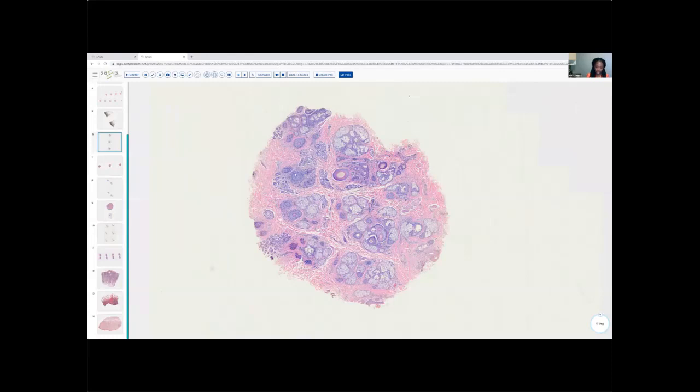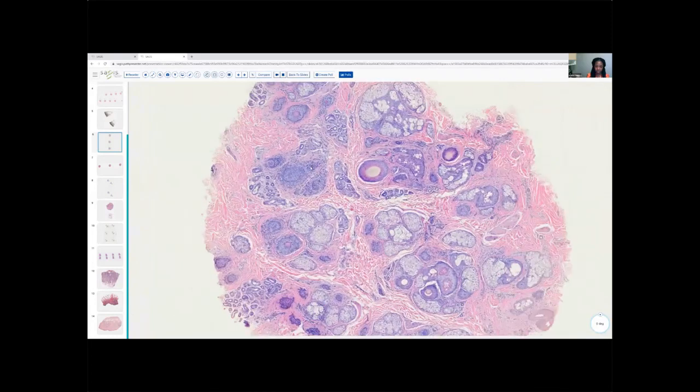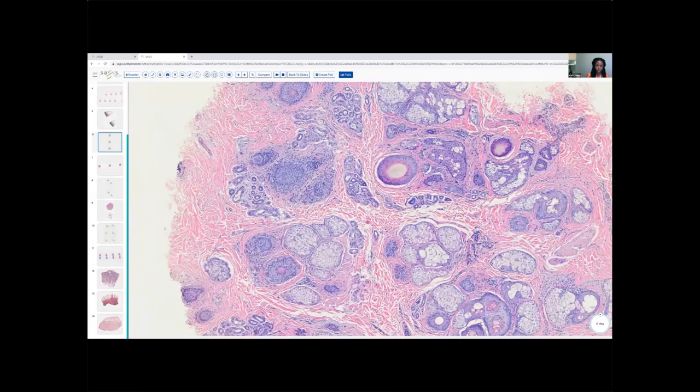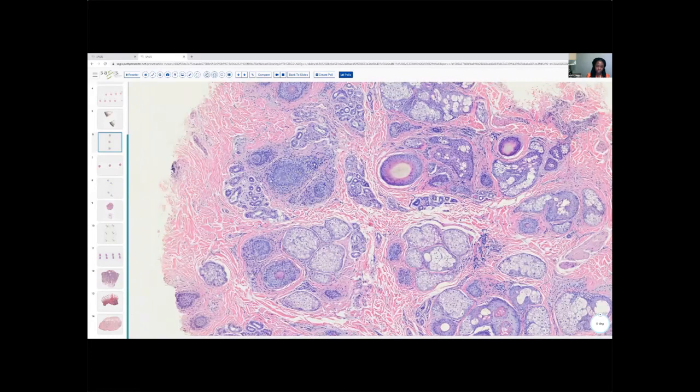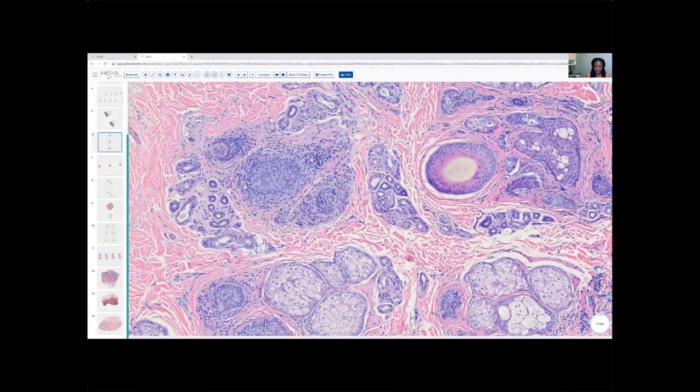But what's so striking here are two things. First of all, this dense perifollicular inflammation. I mean, this is just really, really profound. It looks almost like swarms around this follicle, which is causing some destruction. And when we take a closer look at the cells, these are predominantly lymphocytes. Sometimes we can even have some pigment incontinence from that robust inflammation.